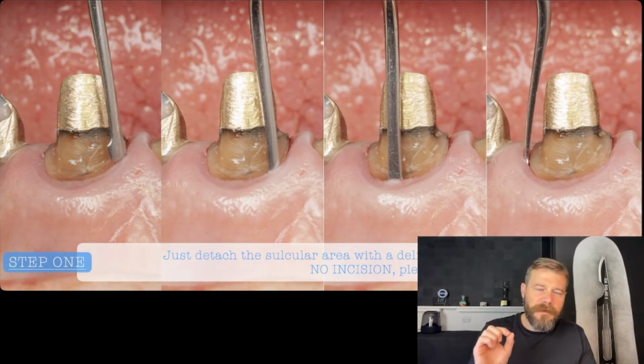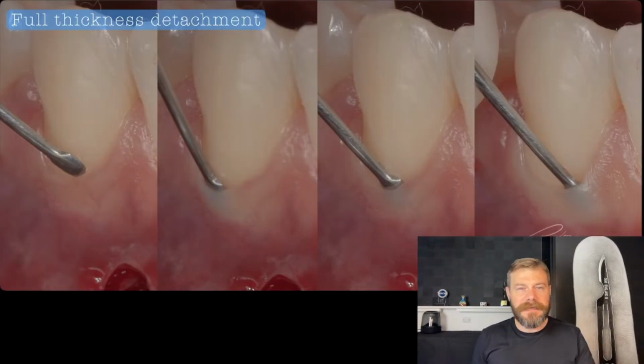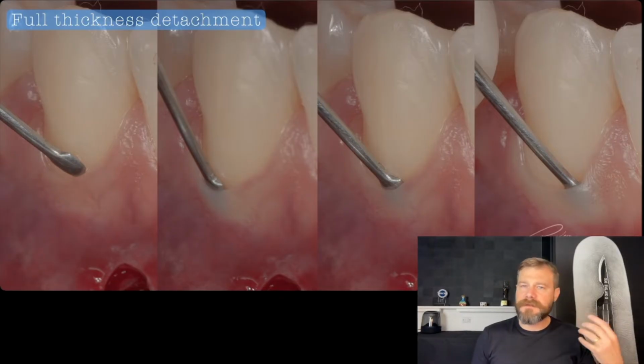But one thing, before I talk about tunneling: when you access the sulcular area, most people do this step with a blade. They make an incision inside the sulcus. And that is not something that we currently do. Why is that? Because most of our patients have a super thin phenotype. You are correcting this super thin phenotype with a connective tissue graft.